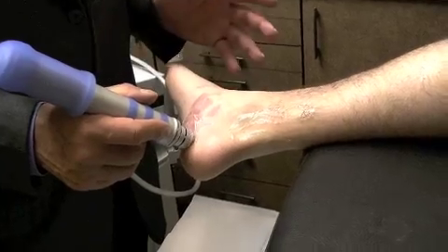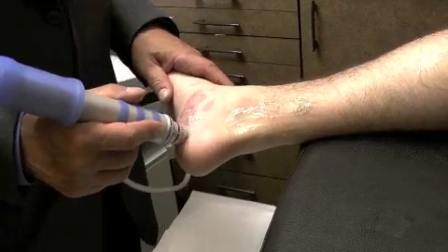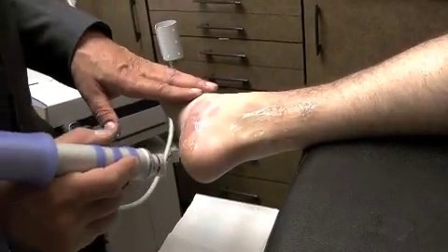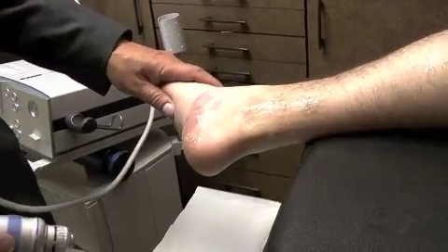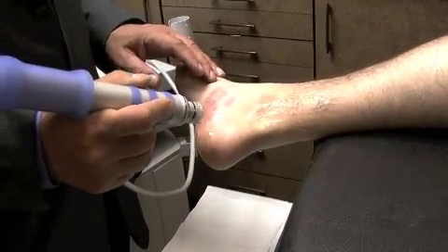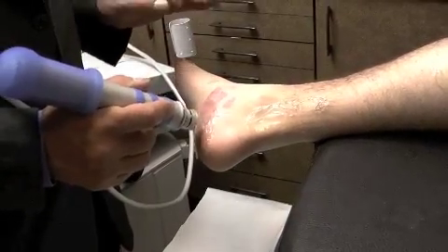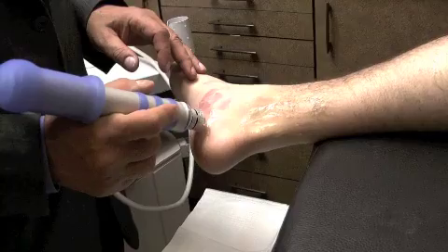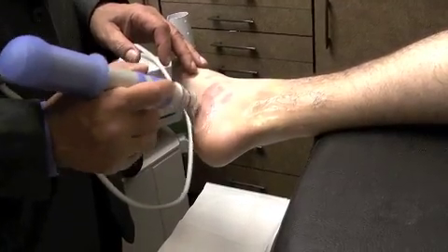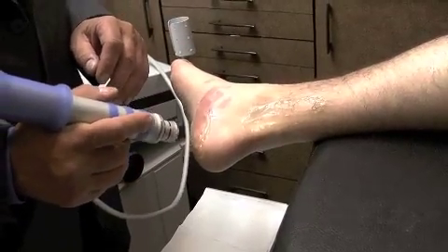And once one has the confidence of this, it's not going to hurt him. It is not nearly as painful. So anywhere from 2,000 to 3,000 of these impulses are what we typically use per treatment. No one has ever been hurt by this machine. We've done FDA studies on it. They had no adverse events, as we call it, ever occur. So it is definitely safe, but it is a little painful, especially when you're dealing with a painful situation.